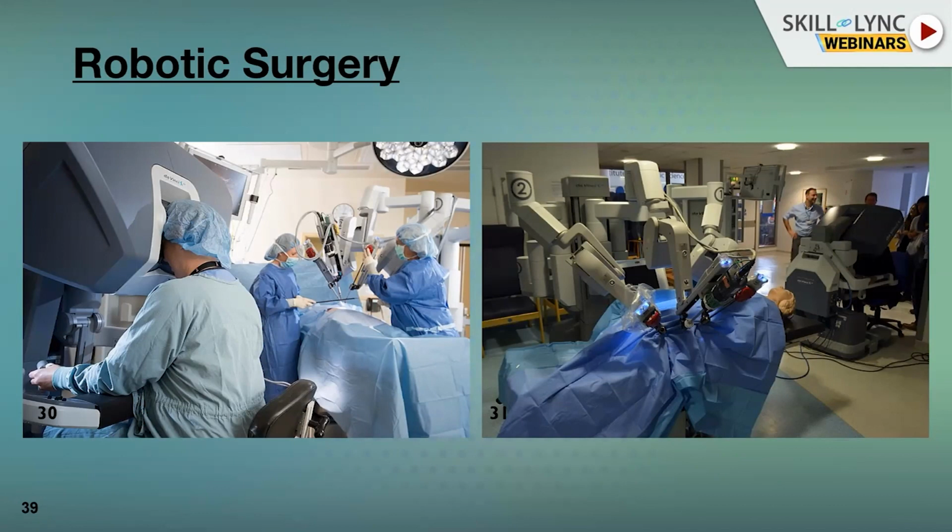The console is like a joystick. Okay, so what does the joystick do? It controls the game, right? The same way, the joystick controls the instrument. So in order to do the surgery from a distance, you use a robotic surgery. That means you have something called a robotic arm, which controls the equipment in a certain way, so that you will not make any mistakes.